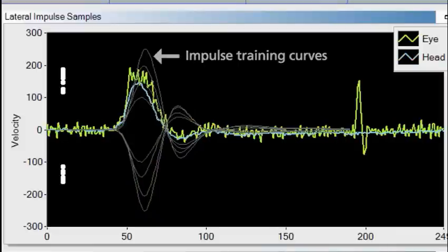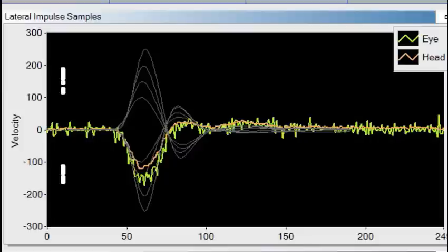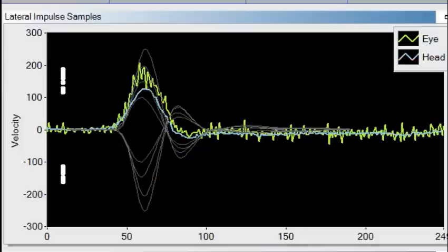Positive velocities represent leftward head impulses. Negative velocities represent rightward head impulses. The actual head and eye trace are superimposed on top of the gray training lines.